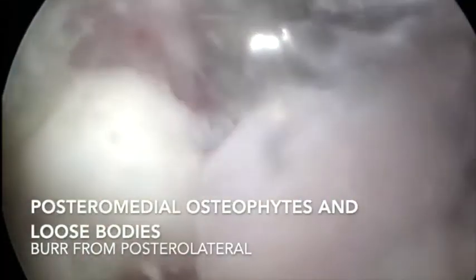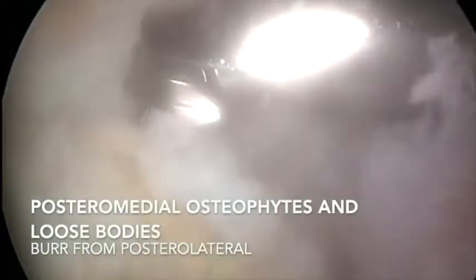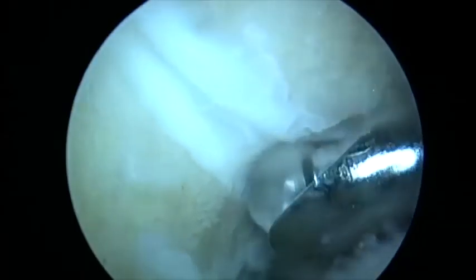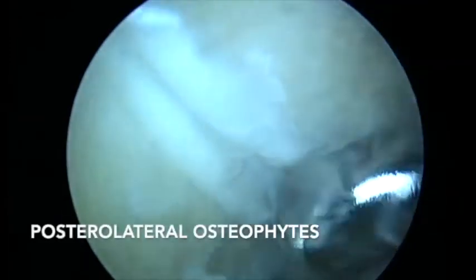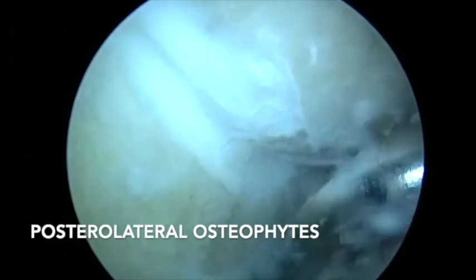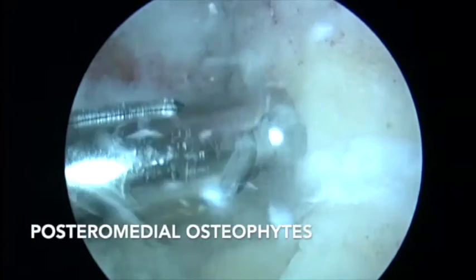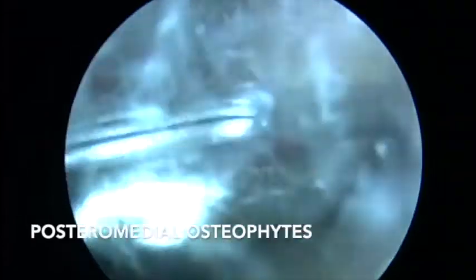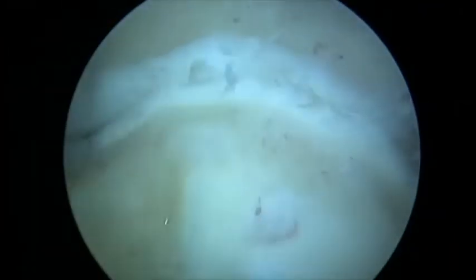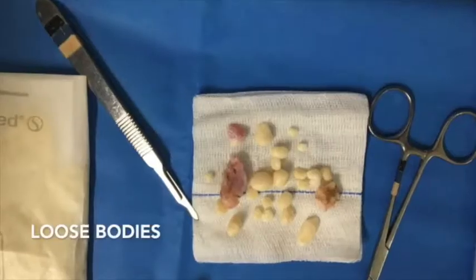In this case we found more osteophytes and loose bodies in the posterior chamber of the elbow. With the scope in the transtricipital portal and the burr from the posterolateral portal, we resected all the osteophytes of the posterolateral olecranon and olecranon fossa. We then checked mobility again.